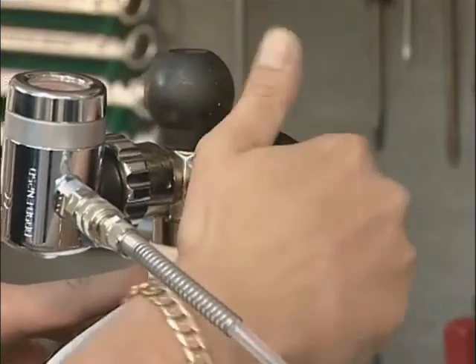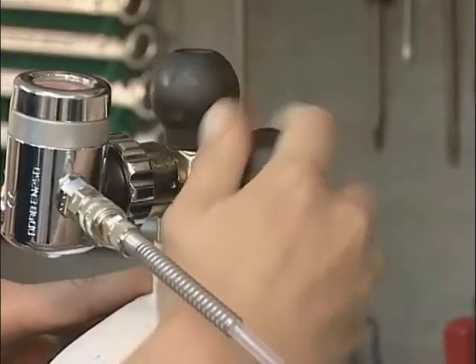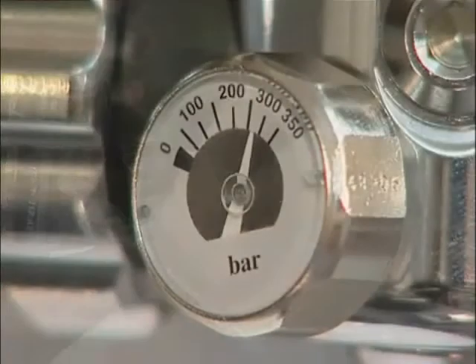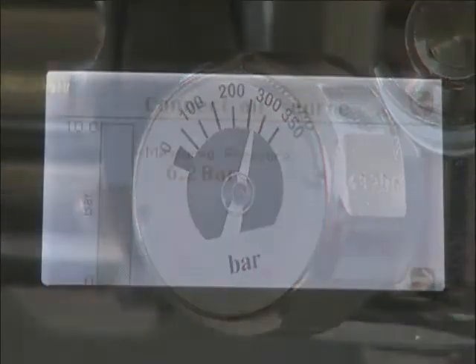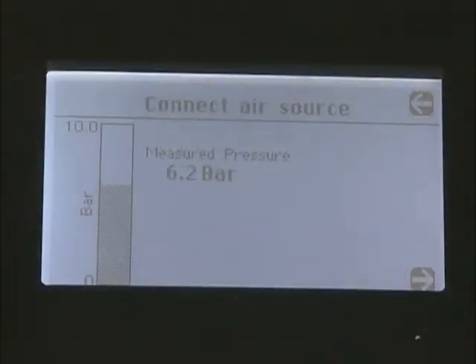Open the cylinder valve and check that the cylinder is fully charged by reading the contents gauge on the regulator. A partially discharged cylinder can give an incorrect water result. The pressure displayed on the tester will be that of the regulated supply from the cylinder and must not exceed 10 bar. Please note that if the unit is over pressurized, it will automatically shut down and display an over pressure warning, and will then need to be returned to the manufacturer for checking and resetting.